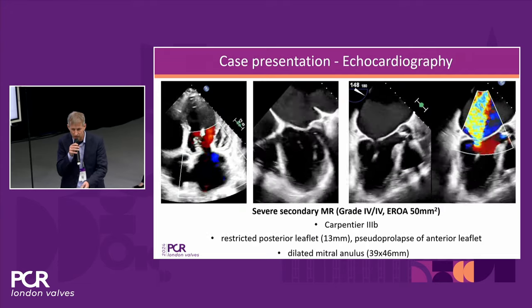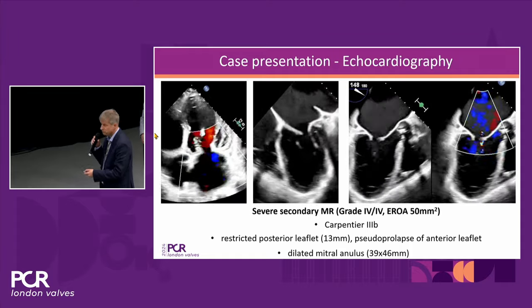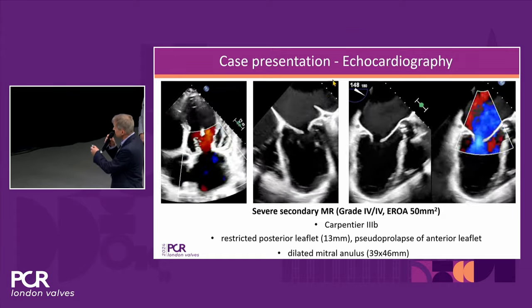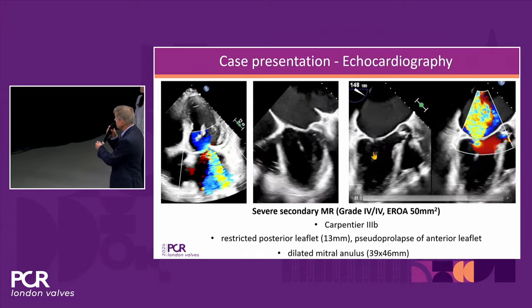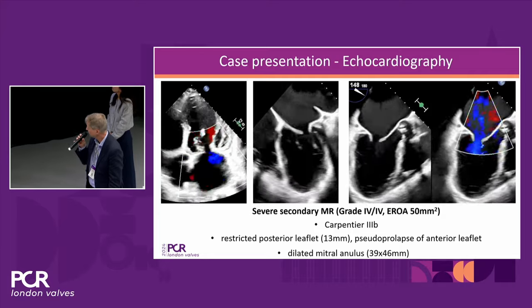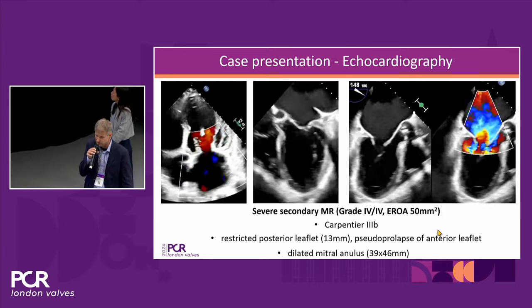And so here the echo. You see the pointer working. The four-chamber view transthoracic shows a very severe mitral regurgitation that goes into all pulmonary veins. The transesophageal echo again shows a severely dilated left atrium. There's restriction of the posterior leaflet and also a pseudoprolapse of the anterior leaflet. You can actually appreciate the gap between the two leaflets that underscores the severity of this mitral regurgitation. Posterior leaflet is 13 millimeters, and there's a dilated annulus of 39 by 46 millimeters.